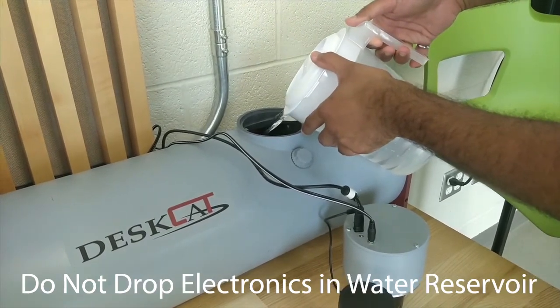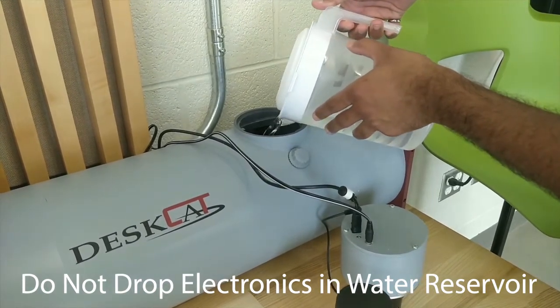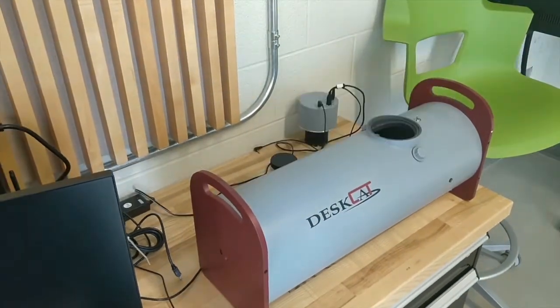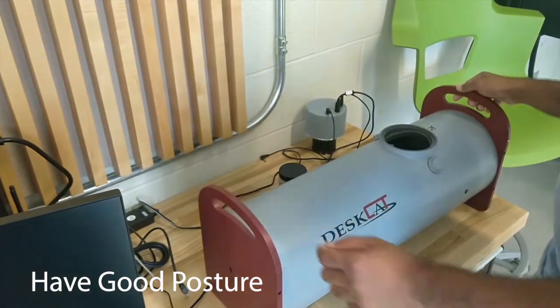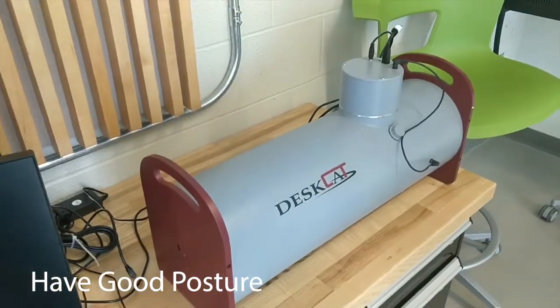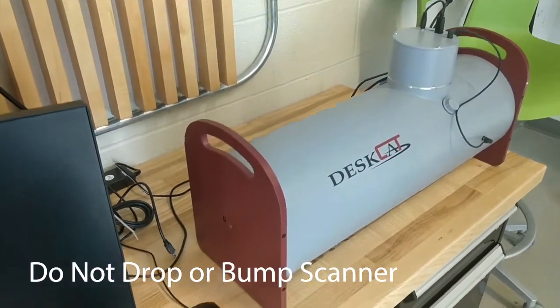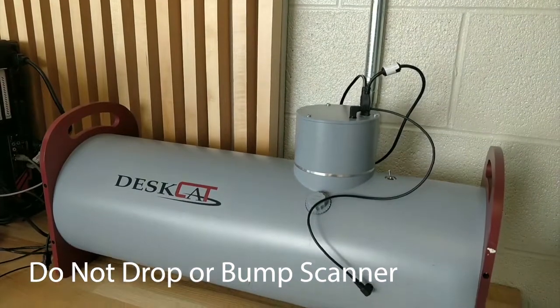Do not place or drop any kind of electronics in the fluid container part of the scanner at any given time. When lifting or moving the scanner, only hold onto the handles. When handling the scanner, always be in good posture to ensure that there is no bodily harm to the user, anyone around, or damage to the scanner itself. Do not drop the scanner on the floor or bump against hard surfaces, as this could cause serious damage to the scanner.